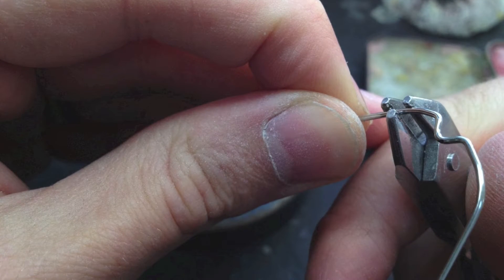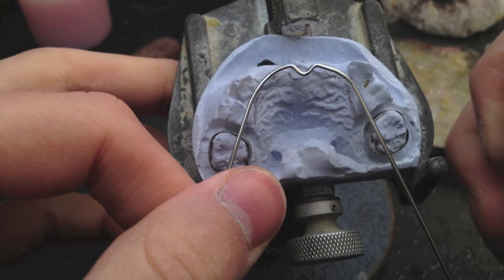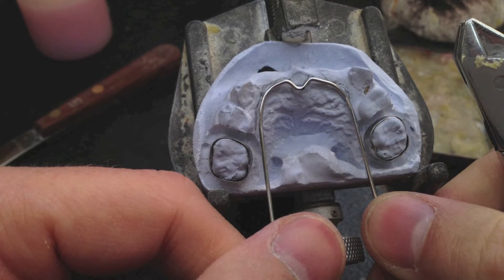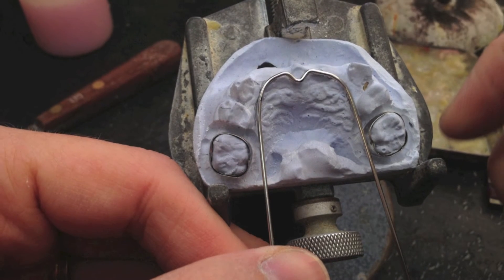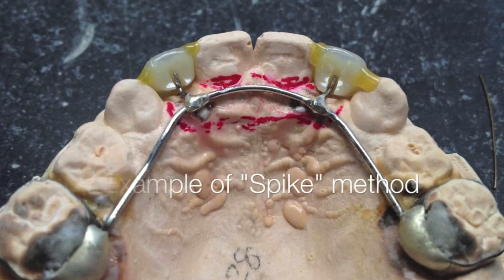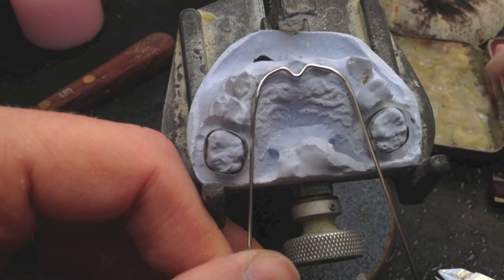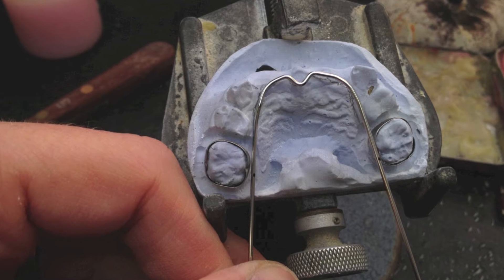Other designs involve soldering a spike on the front of this lingual arch and then drilling a hole in the pontic and setting the pontic on the spike and all that. This design is real simple and it's good for four-tooth pedo partials. The spike method is good for just single-tooth pedo partials where there's not much support acrylic around that tooth. This one's going to have a lot of support acrylic from canine to canine, and on the labial side there'd be a lot of acrylic too.